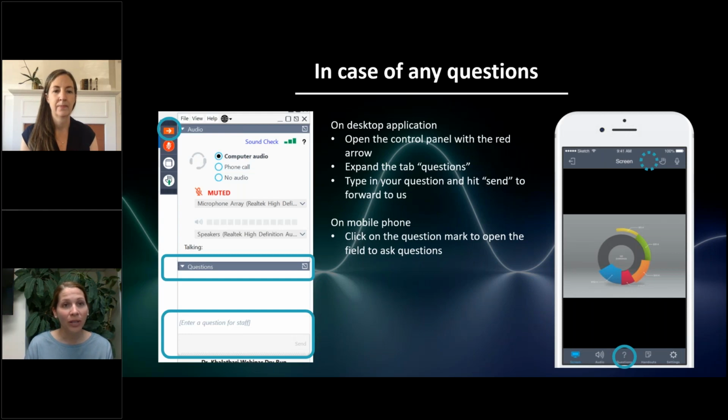The next question is, is there a way to do focal stimulation with the pupillometry? Most desktop pupillometry is done with systems that are usually head mounted with little IR cameras on it, and a lot of it's used for eye tracking rather than just for pupillometry. So once that's used, you can expose them to any stimulus that you want. For our specific purposes, we were using a full field stimulus, patterned after my collaborator Jason Park's work designing a pupillometry protocol that was useful in clinic. If you wanted to do a focal stimulus, you would just need some sort of light stimulus that would generate that. The Red-Eval, as it's built, is a Ganzfeld dome with some LEDs in it, and so isn't currently set up to do spatially distinct stimuli.